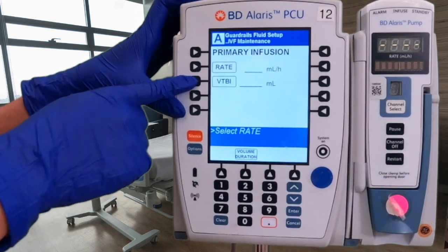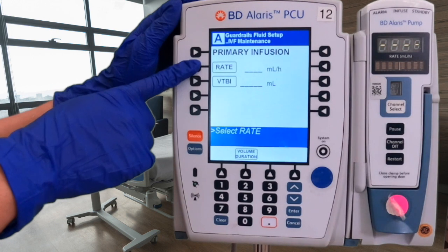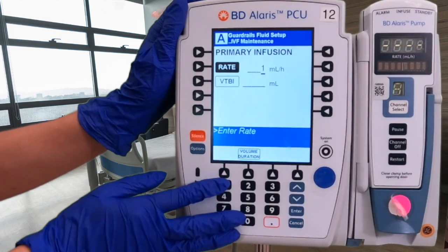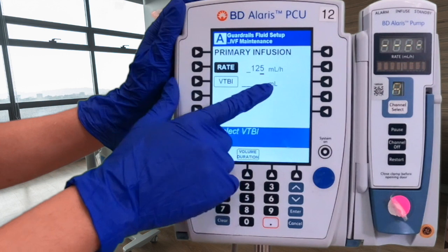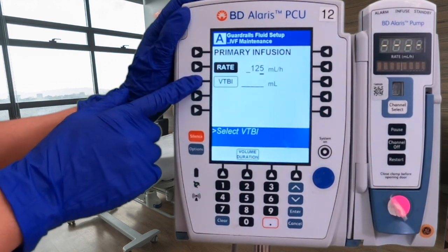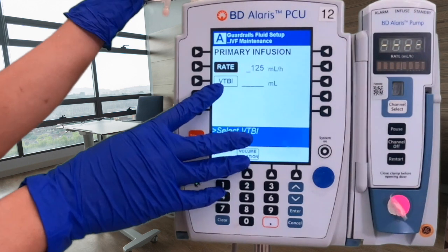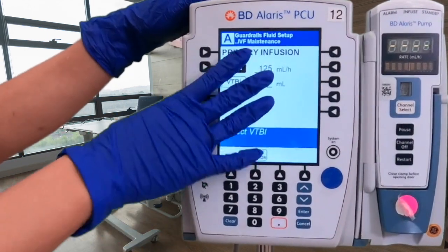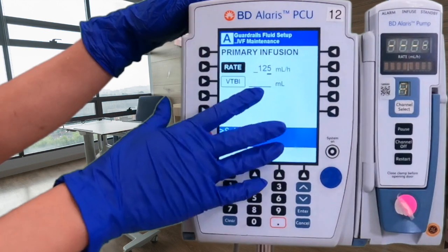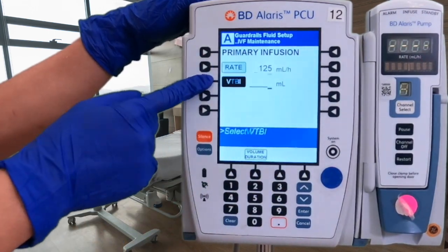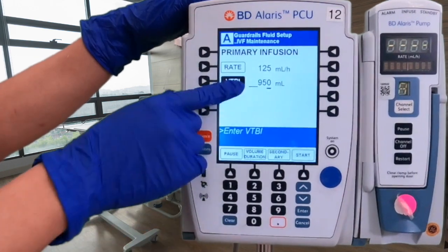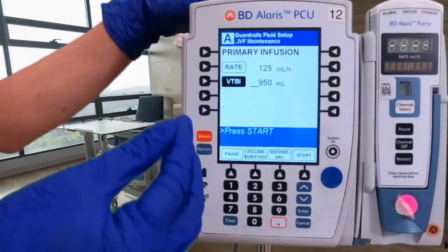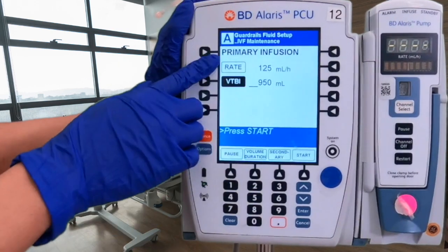Now we are at the rate and volume to be infused screen. Per the doctor's order of 125 mL/hr, press on rate and enter 125. For the volume to be infused, we have a liter bag (1000 mL), however I'm going to program it for 950 mL so the bag is not sucked dry and we have a warning to come back and check on things.